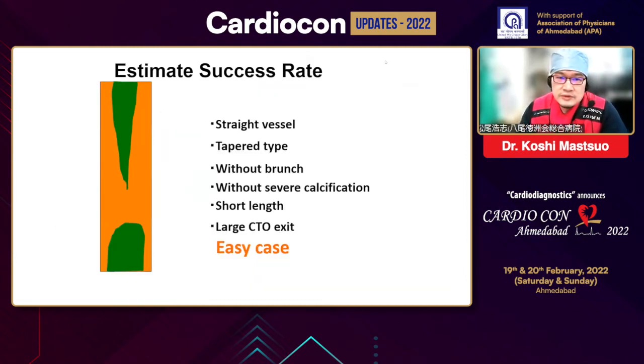The CTO vessel is straight. The CTO entry is tapered. Around the CTO entry there is no side branch, and inside the CTO body there is no severe calcification. The CTO length is short and the CTO exit is large. This case is an easy case.